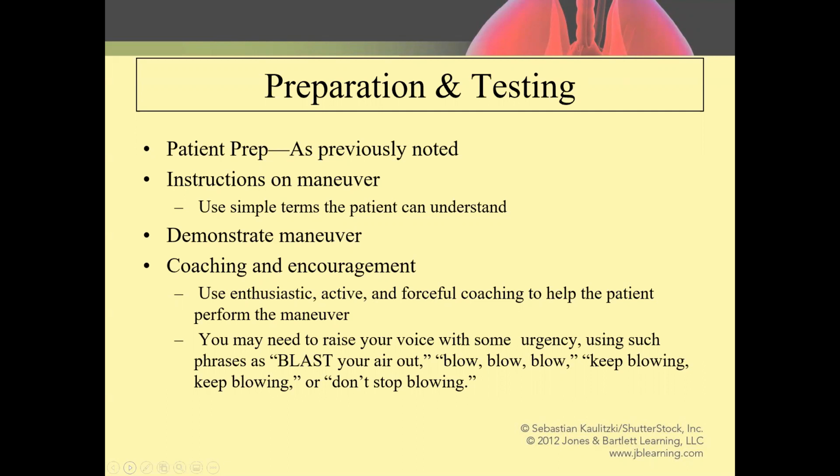They tend to close the door in our pulmonary function testing labs. We have more than one room, but you can still hear right through the door. It sounds a little like a torture chamber. You're not sure what they're doing in there. I don't hear any bumping and crashing, but you hear a lot of, I'm going to call it yelling, or as we said in this slide, forcefully coaching.